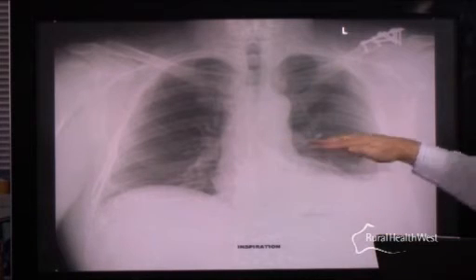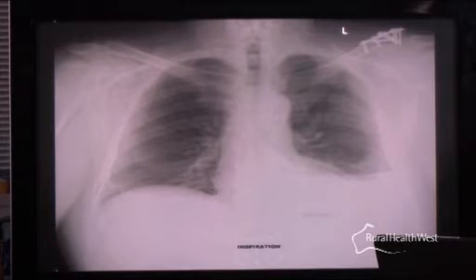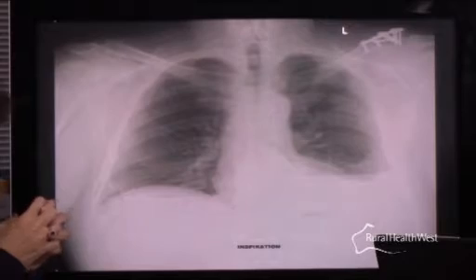If you could follow the pneumothorax down, and look toward the level of the region of the hilum, if you have a pneumothorax which is roughly about 2 centimetres deep, it usually means that there's about 50% loss of volume of the lung. So normally you're talking 2 centimetres, so it would have to be circumferential going down. There are formulas you can use if you want to be scientific, but 2 centimetres from the side and 50% loss of volume sounds pretty good to me. And that tends to be the point at which people would start thinking about putting in an intercostal catheter or draining the pneumothorax.